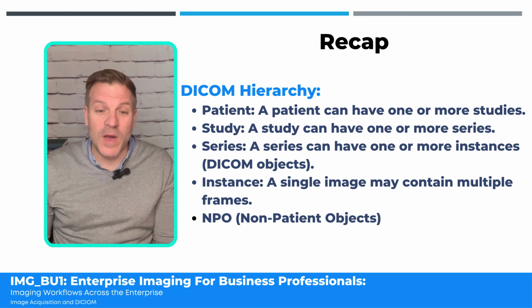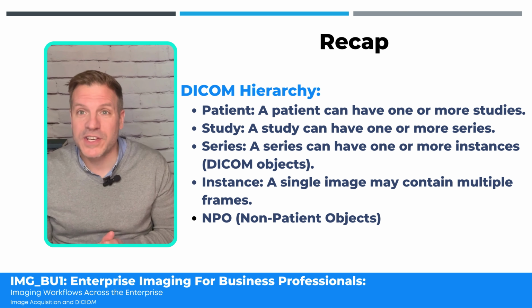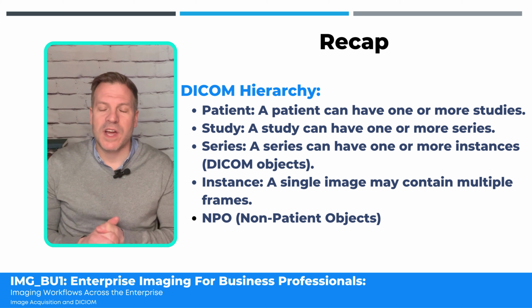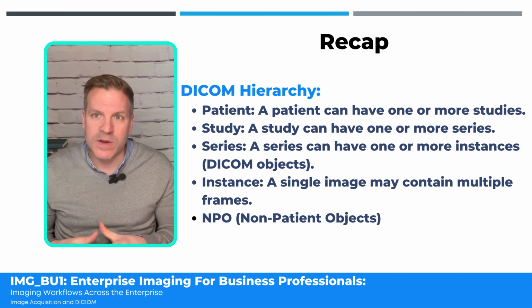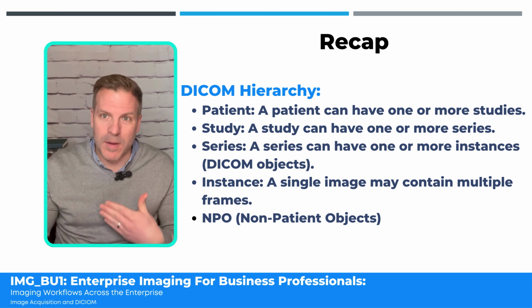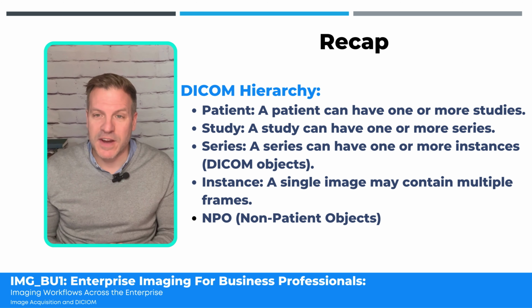successful way. So in this section, we looked at the DICOM hierarchy, where there is a single patient that sits at the top. That patient would have one or more studies associated with them. The study would have one or more series within it. The series is a collection of instances over a period of time or from a general area or perspective.